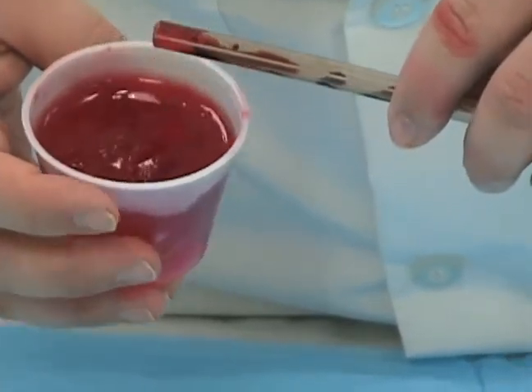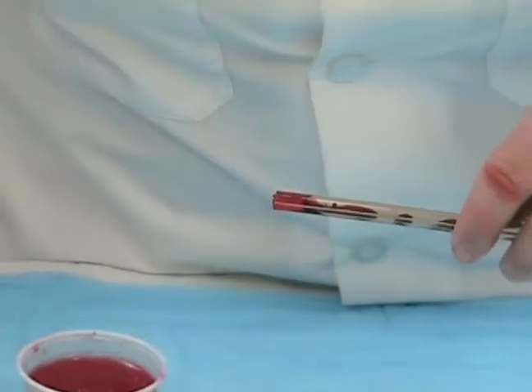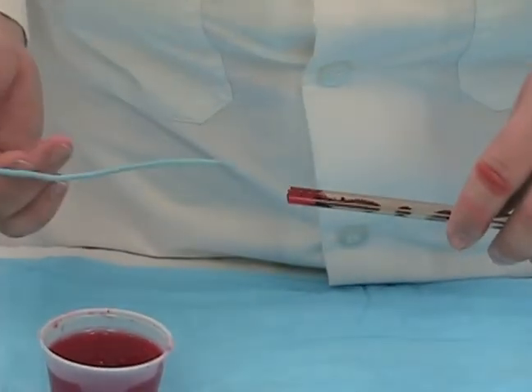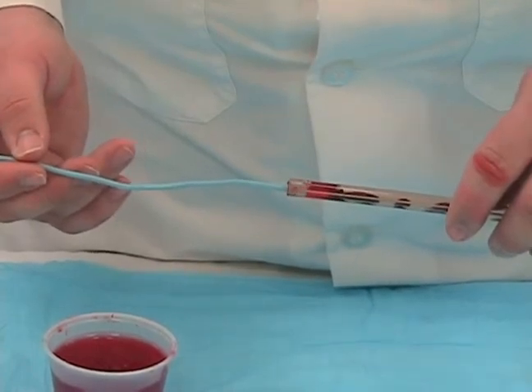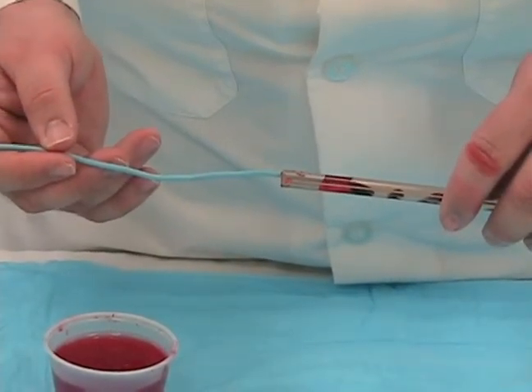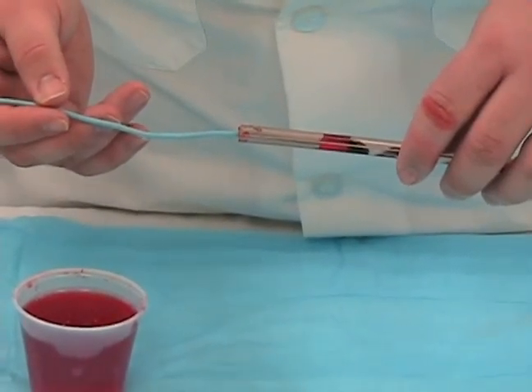Now that you have the jello inside the tube, you need to move it into proper position. Use a stylet to manipulate the clot and get it to the desired position in the chest tube. Prepare the chest tube 1 to 2 days prior to the simulation and refrigerate to prevent the jello from becoming too soft.